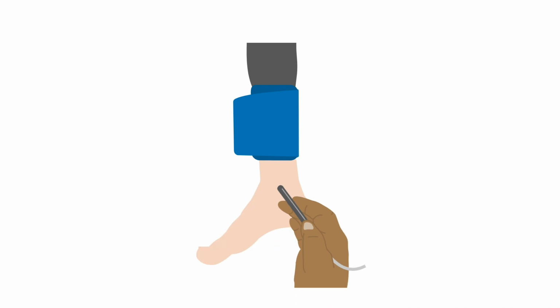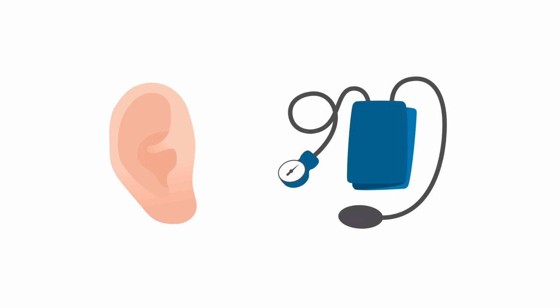To find the right posterior tibial artery, PTA, start just behind the medial malleolus, or inner ankle bone, and slide posteriorly toward the Achilles tendon. You will cross the PTA. Use enough gel to get good contact with the skin. Listen for the waveform and obtain the pressure. Remember, the higher systolic number is used regardless if it is the DPA or the PTA. This number will be the numerator for the ABI equation.